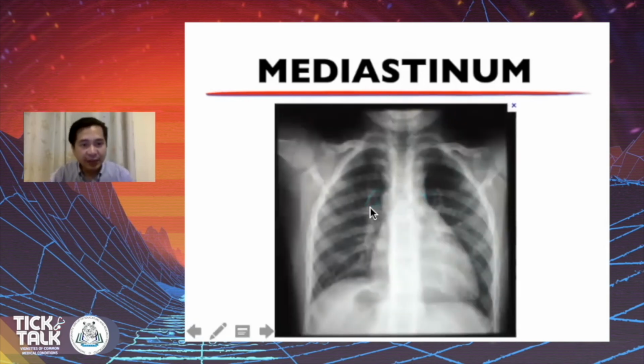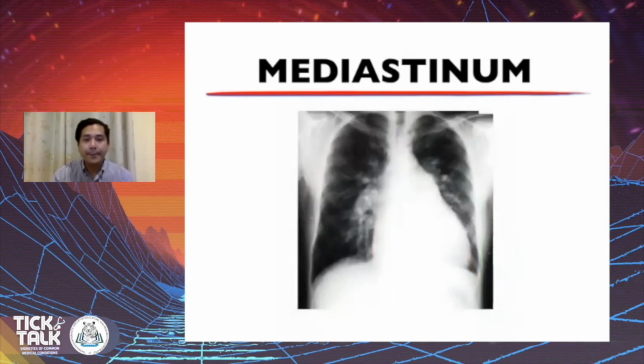In this film, the trachea is in the midline. The apex is past the midclavicular line. There is no apparent lung pathology causing displacement of the apex, and it is obvious that the heart itself seems enlarged. The normal cardiothoracic ratio is 0.5. This patient has cardiomegaly or heart enlargement. Another one here. You can see the trachea in the midline. The apex is displaced. The heart is enlarged. You have a very big right descending pulmonary artery. This is called the thumb sign. It represents pulmonary hypertension.